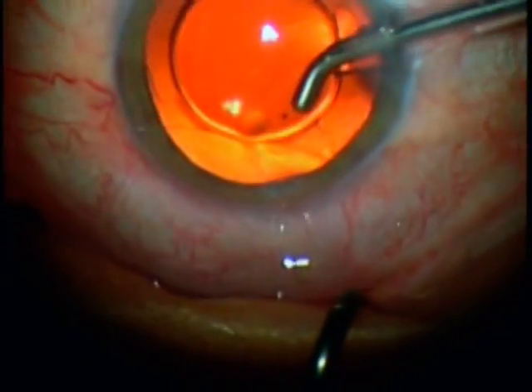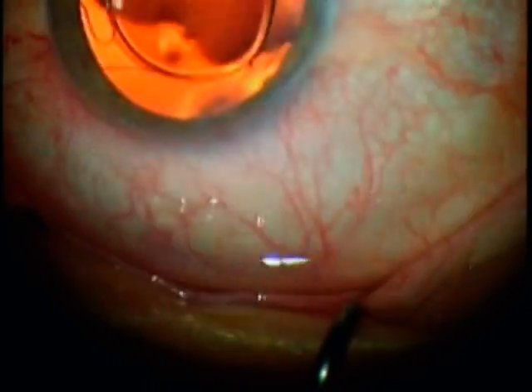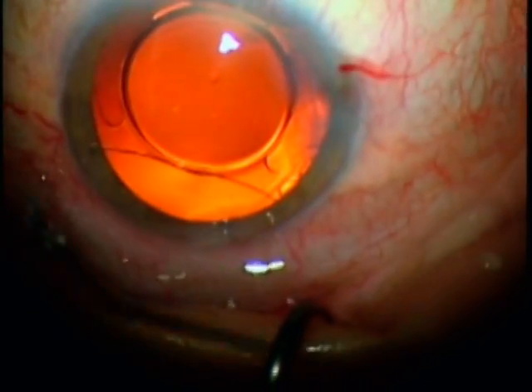The 2.2mm incision is small enough that usually the wound is not hydrated, and the surgery is completed safely and quickly. Thank you for your time.